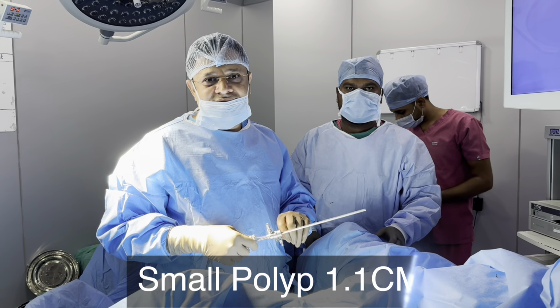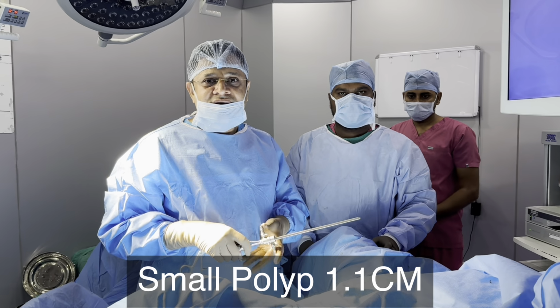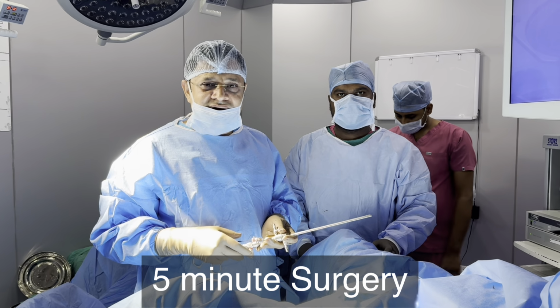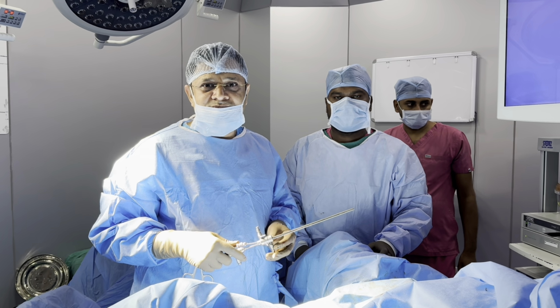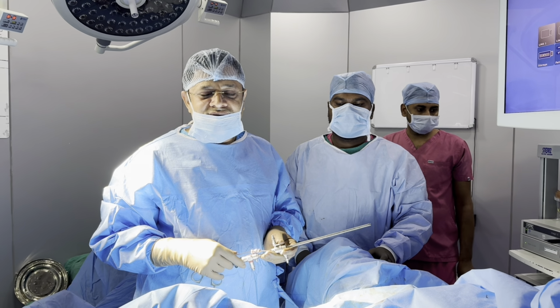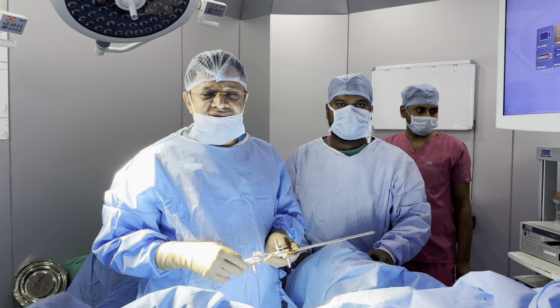It was a very small polyp of 1 by 1 centimeter. It took hardly 5 minutes for us. Also, we have evaluated the cavity, and there is no major problem in the cavity, and she will be ready for going with the infertility treatment from next month itself.